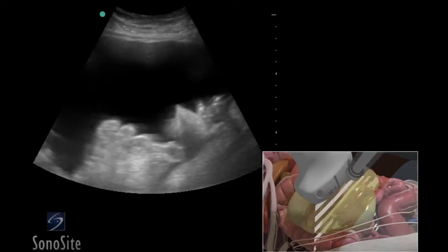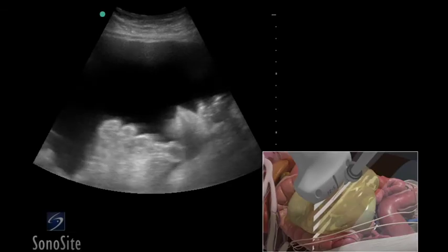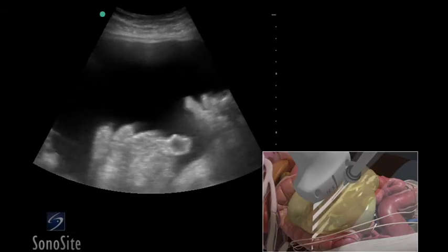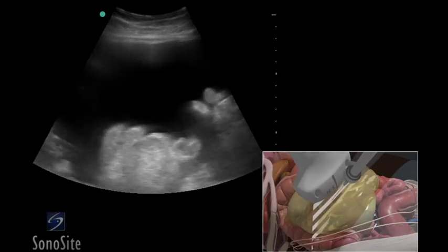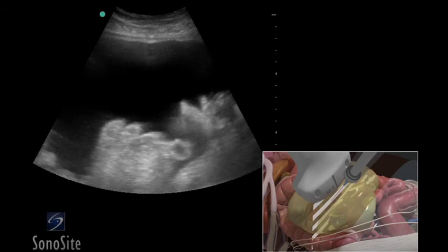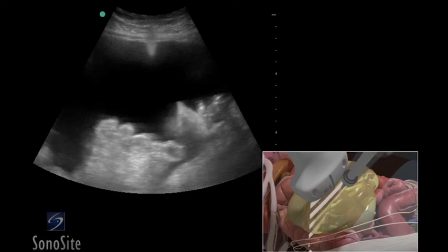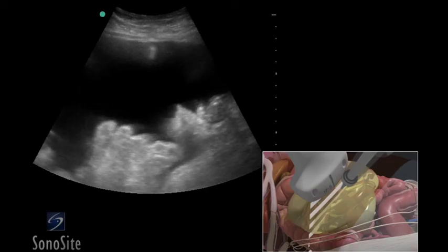Follow the needle entry by slowly sliding the transducer in the direction of needle advancement. The needle will appear as a small bright hyperechoic dot. When the needle tip appears, the transducer should be advanced a short distance distally to follow the tip of the needle trajectory. The needle is slowly advanced under direct ultrasound visualization until the tip is seen to indent and then puncture the parietal peritoneum. The transducer should be moved slightly proximally and distally to confirm location of the needle tip.